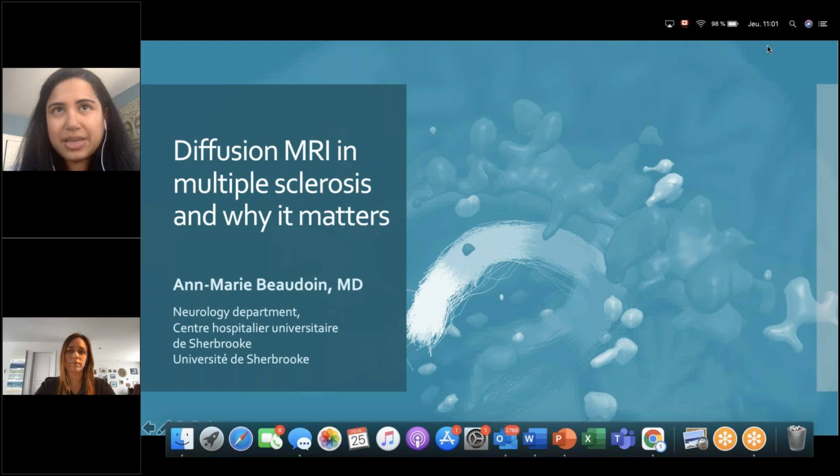I'll start off by giving a summary of today's webinar, and then I'll tell you a little bit about the speaker. Multiple sclerosis, or MS, is an autoimmune neurodegenerative disease of the central nervous system, characterized by inflammation, demyelination, gliosis, axonal loss, and atrophy. Conventional MRI is sensitive to white matter changes in MS, but it lacks specificity for the underlying pathological processes. Advanced diffusion MRI methods have the potential to better probe white matter abnormalities by providing tissue-specific measures.